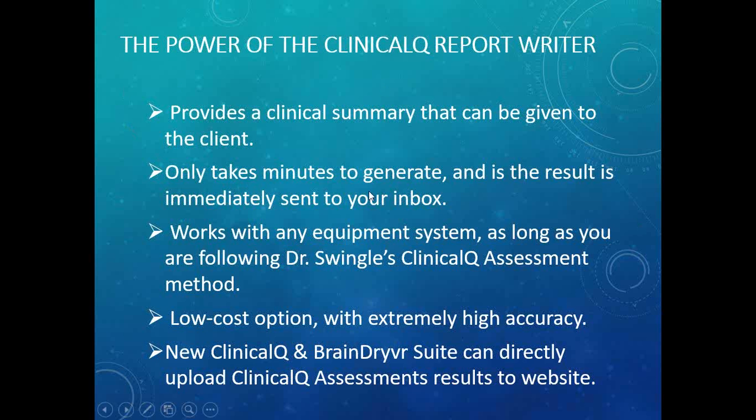So here's pretty much just a synopsis of what I've been saying quite a few times. The ClinicalQ Report Writer gives the clinical summary based on the client-specific case. It only takes a few minutes to generate, and it works for any type of neurofeedback equipment. It's not only Thought Technology or using the BFE's ClinicalQ BrainDryvr suite, but anyone who follows Dr. Swingle's ClinicalQ assessment method can do this. It's actually quite low cost, and I'll explain that in a second.